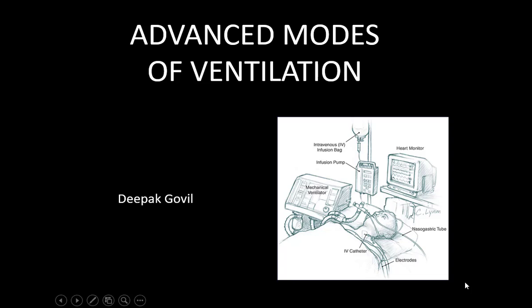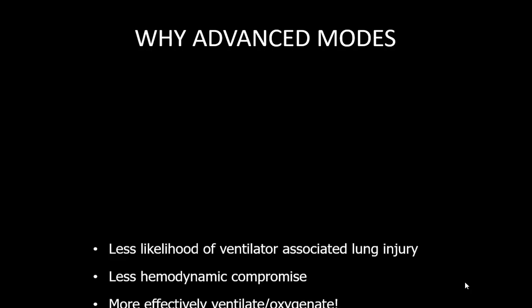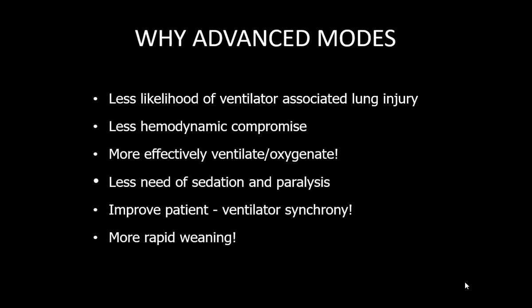So now I'll be talking about some different modes. Believe me, they are not too advanced or too new modes, but the names are like this. So why do we require separate modes apart from pressure and volume control, different modes?